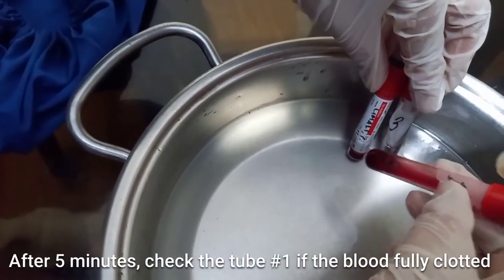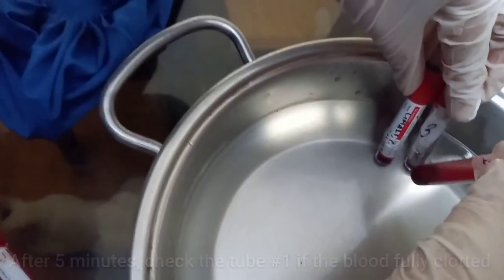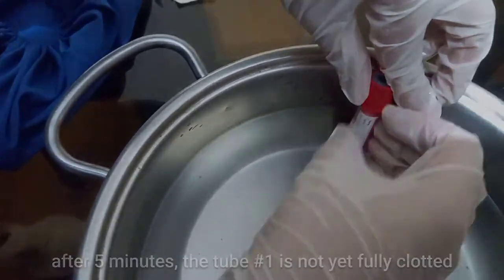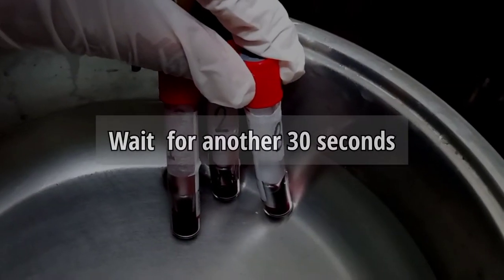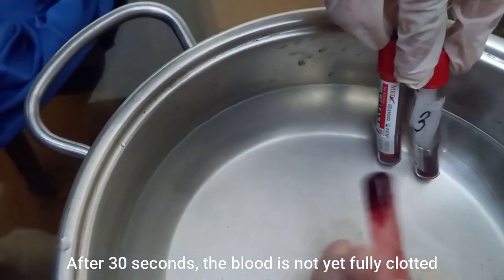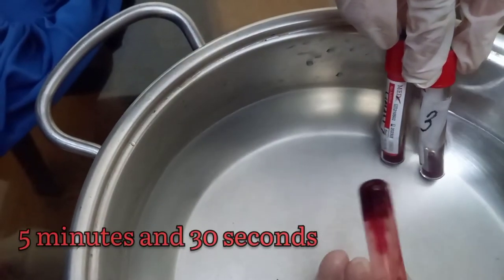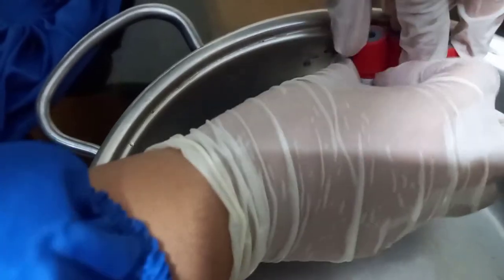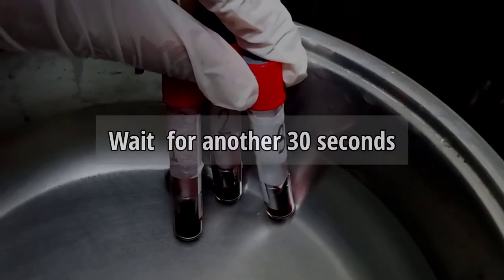After 5 minutes, check test tube number 1 for clotting. As you can see, it is not yet fully clotted, so we will wait for another 30 seconds. After 30 seconds, the blood is still not yet fully clotted, so wait for another 30 seconds.